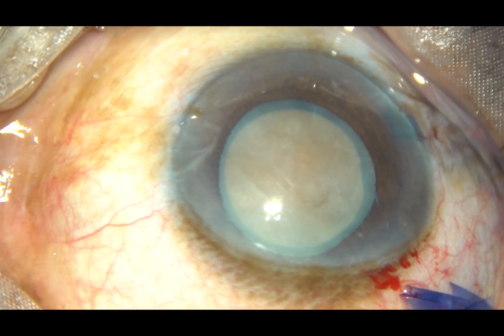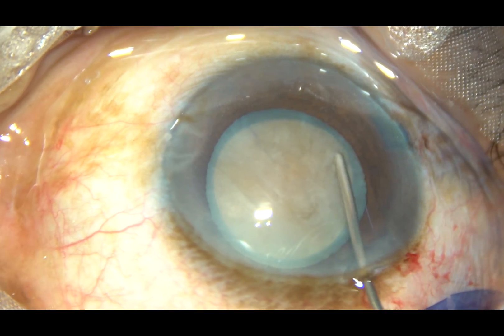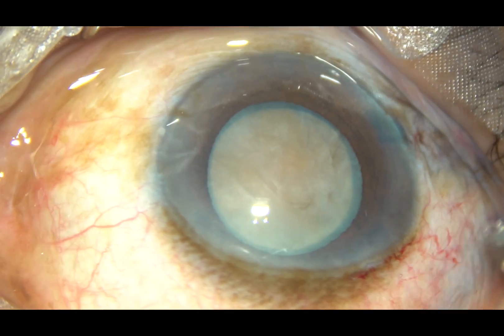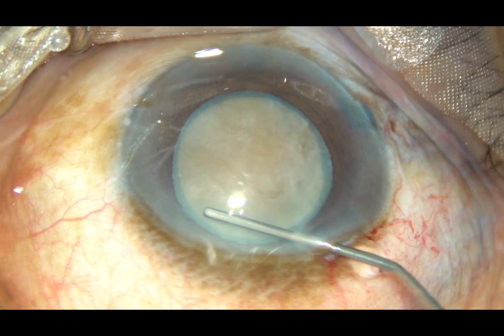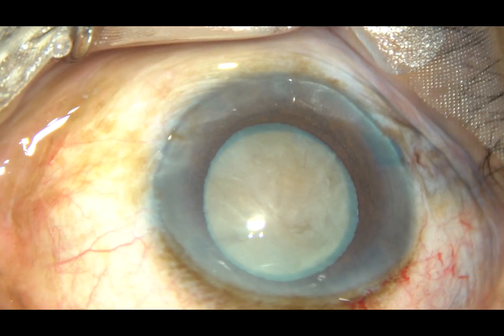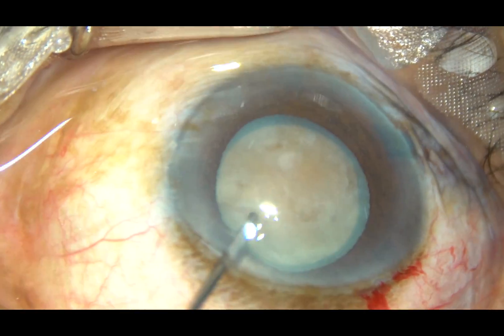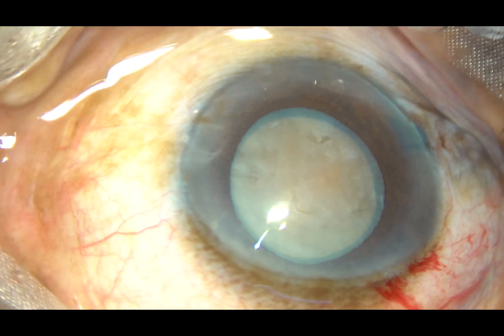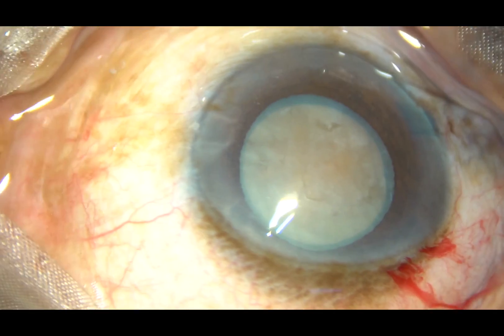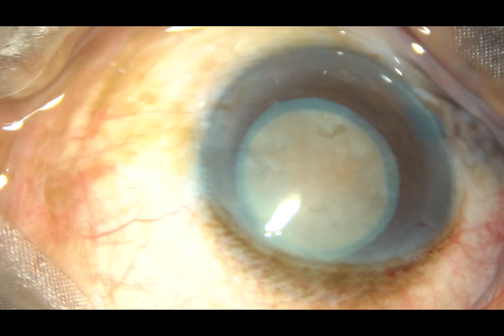And this has been very satisfactory — an adequate-sized rhexis. Now I am going just under the anterior capsular rim. I am very careful not to touch the iris. Now I see that the nucleus is rotating nicely.